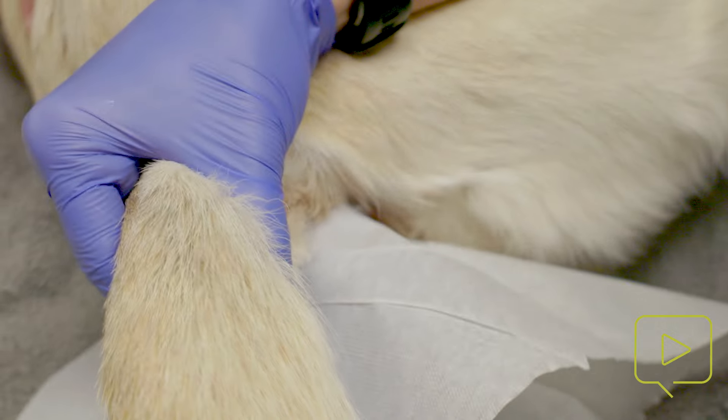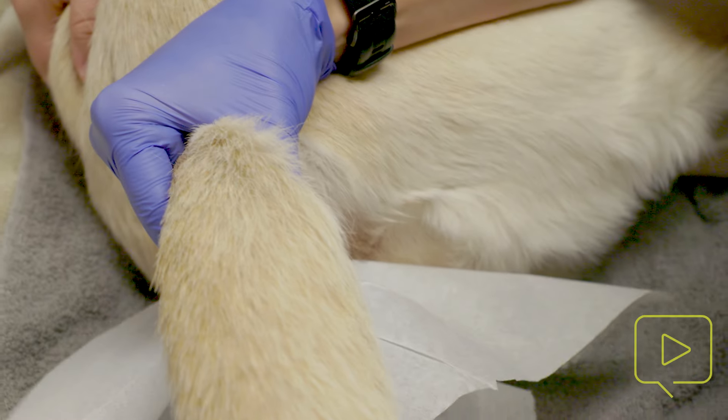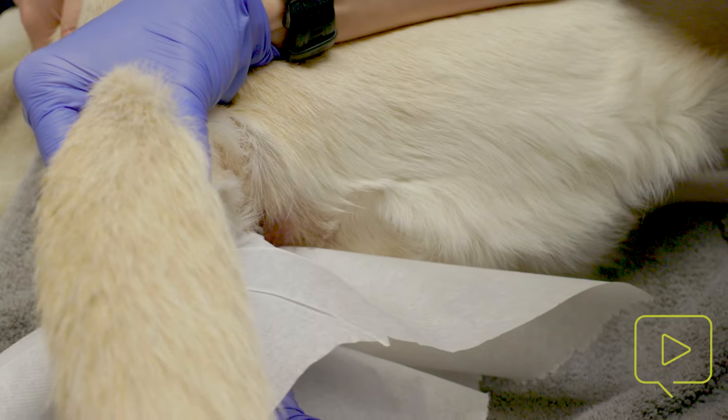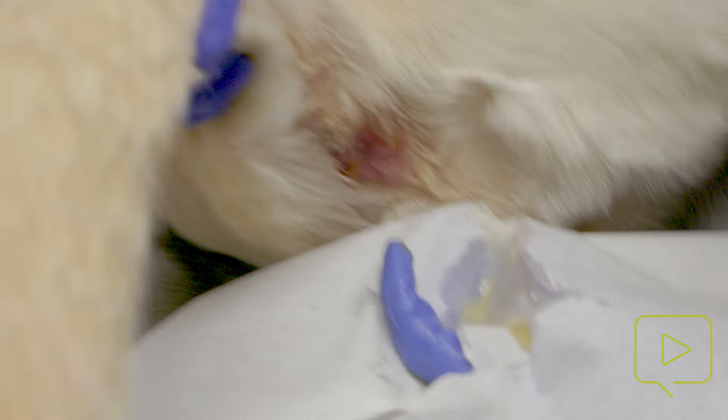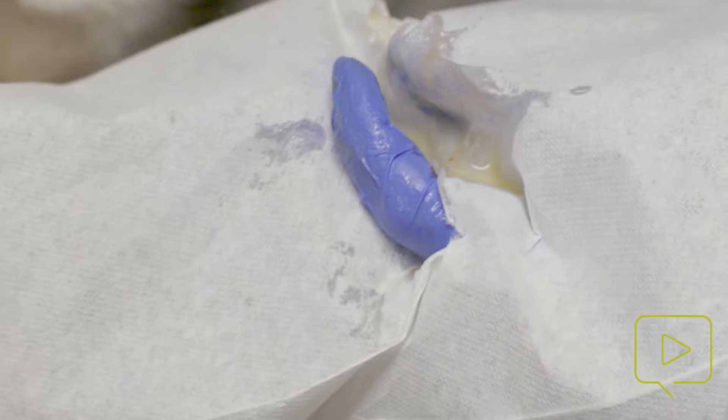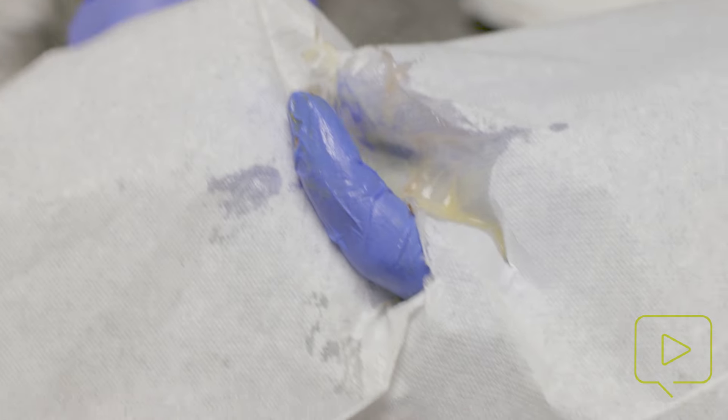I'm doing that right now. This side is taking a little more effort because the material is abnormal — it's purulent, so this dog is beginning to abscess. That's not normal material, and we'll be checking her regularly.